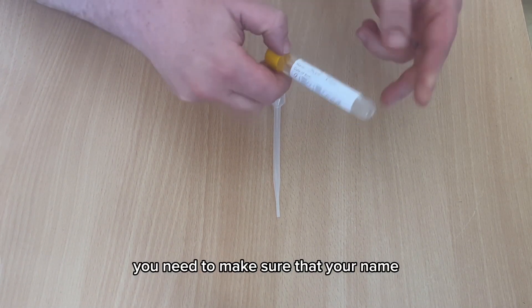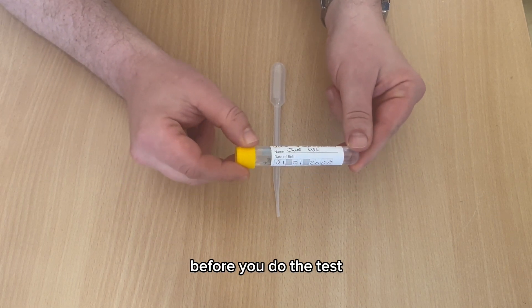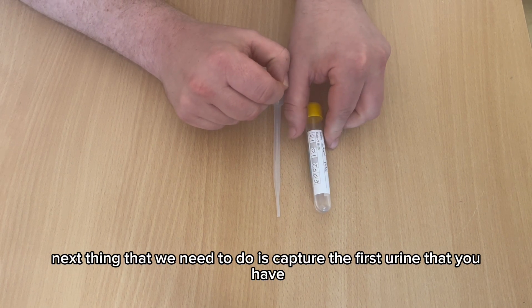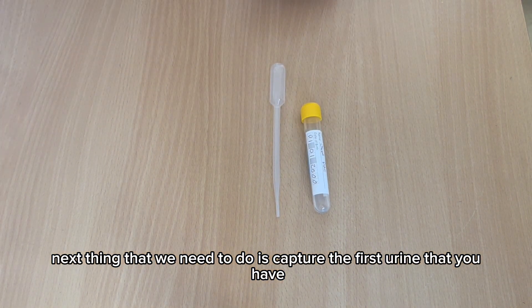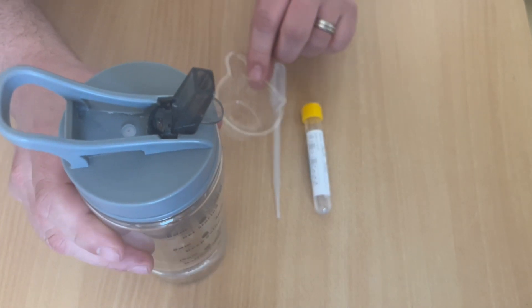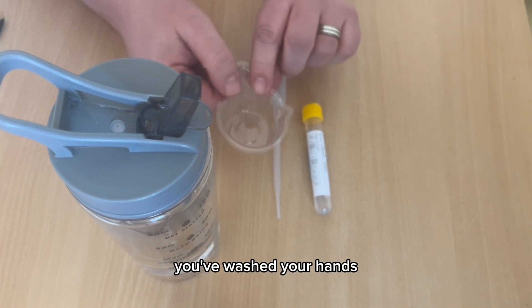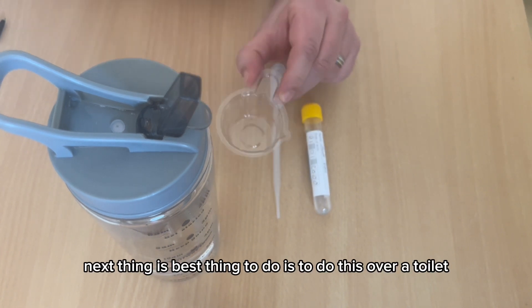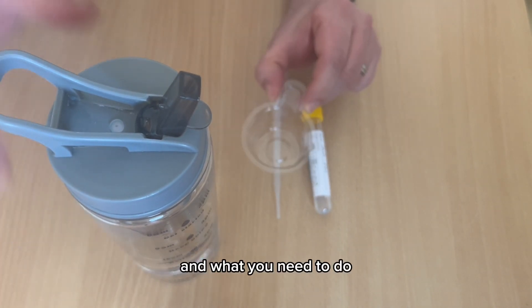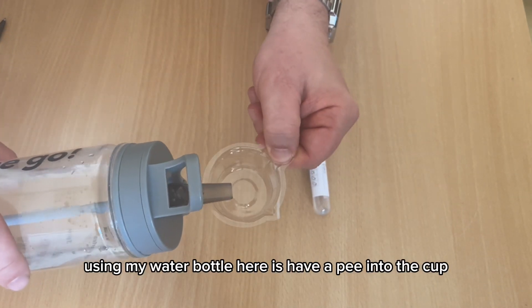Once you've unpacked your kit, make sure that your name and date of birth is on the bottle before you do the test. Next, you need to capture the first urine that you pass. We'll be demonstrating with water. Make sure your hands are clean — wash your hands first. The best thing to do is to perform this over a toilet, then urinate into the cup.